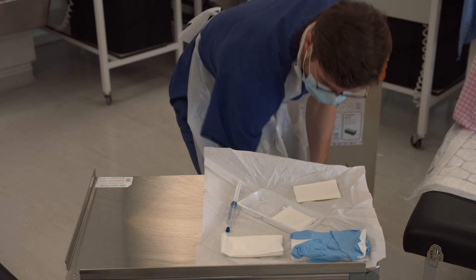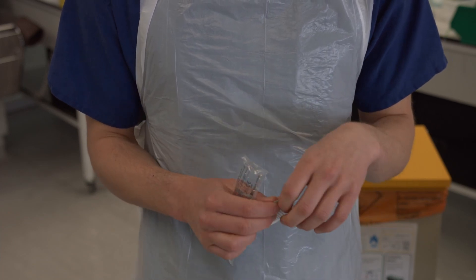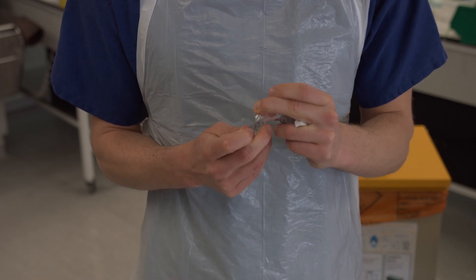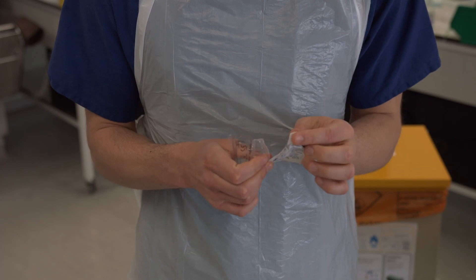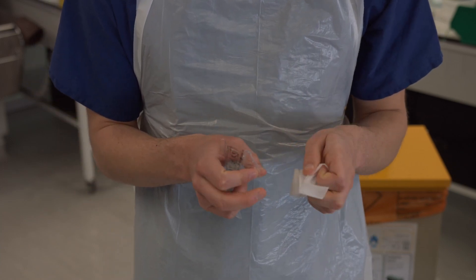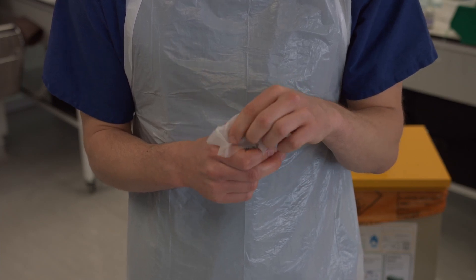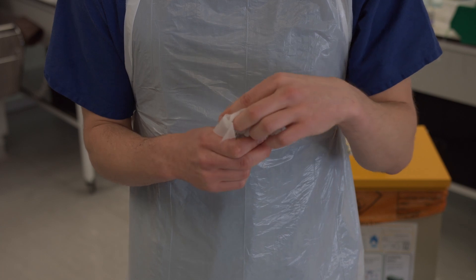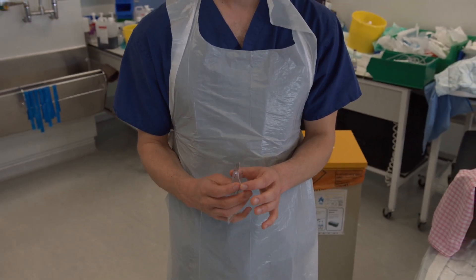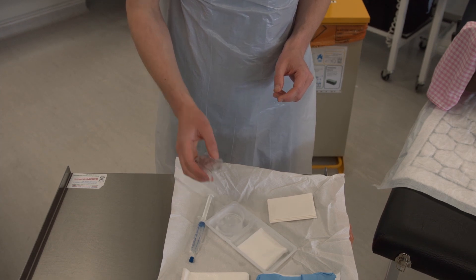Pick up the sterile water and the chlorhexidine wipe. Check that the water is in date. Open up the top of the wipe packet and then the top of the water packet. Use the wipe to thoroughly clean the top of the water packet. Pour the water into the plastic tub in your field without touching the packet to the tub or the field.